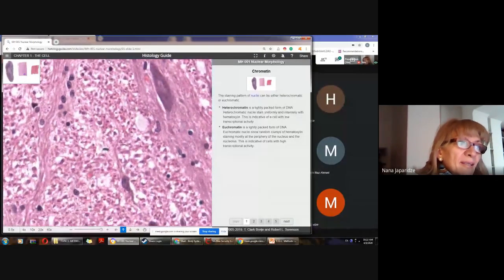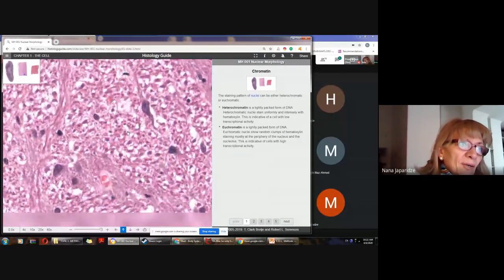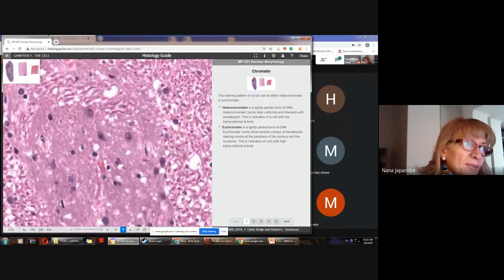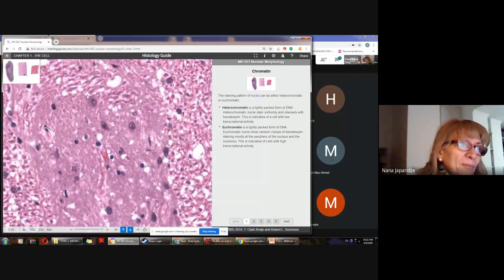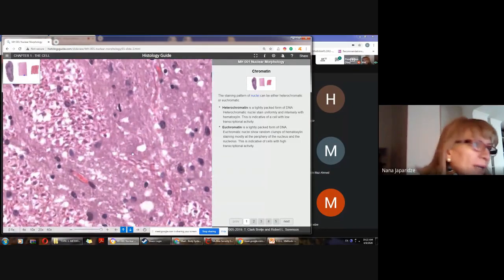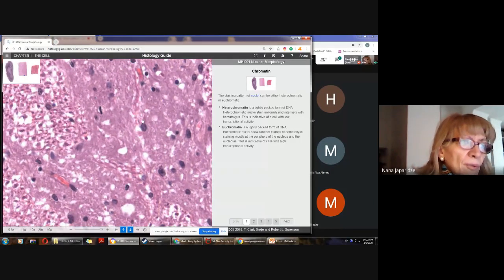And this is white matter, which contains mostly processes of the cells. And these processes, axons especially, they are myelinated. So again, gray matter with the cell bodies. Okay, in any case, you see that the nucleus is the most dark stained part.